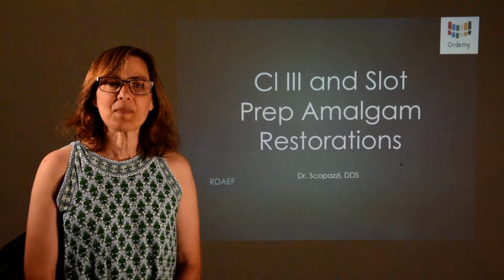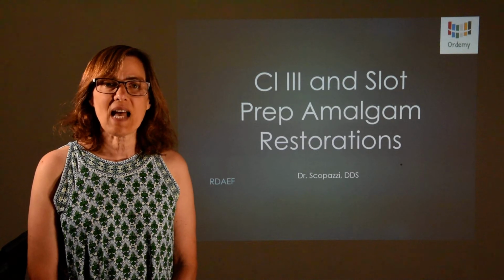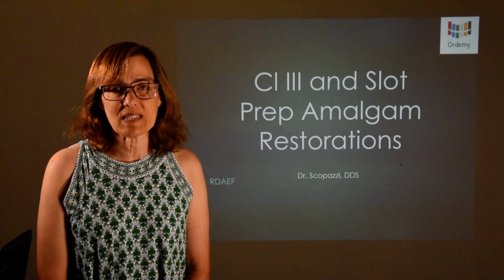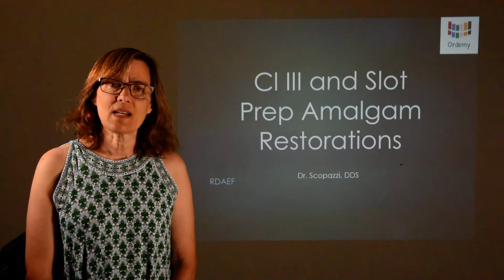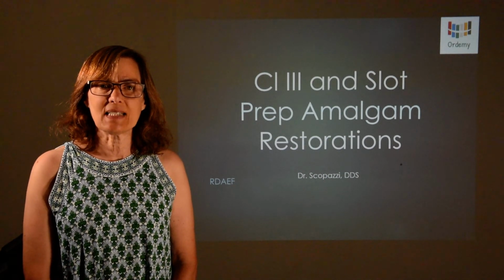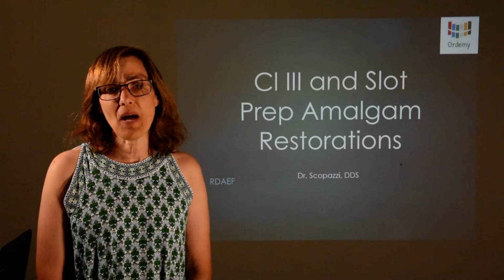Hello. My name is Dr. Scopazzi, and I will be reviewing the Class 3 restoration, specifically using amalgam as the restorative material. Amalgam was introduced in the U.S. at around 1830, and it is composed of silver, tin, zinc, and mercury, hence the name amalgam.